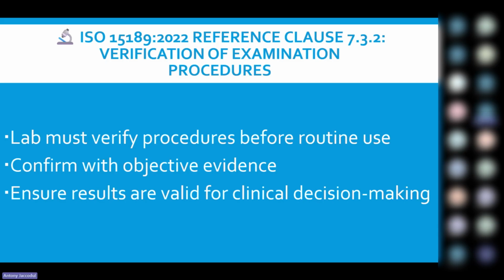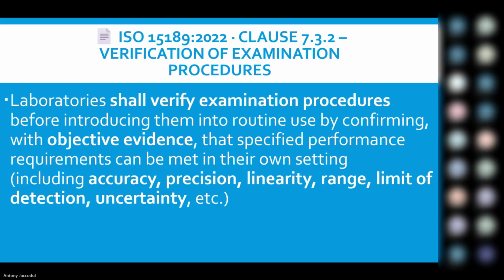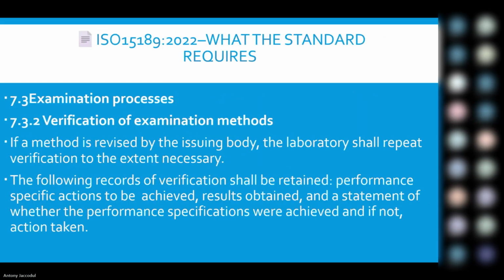So this is just the requirements of the standard. You need to verify for better clinical decision-making. I know the current standard has placed a lot of emphasis on accuracy, precision, and linearity. And as good students of the standard, as things become more strict and stringent, the next revision will have those elements of carryover as well.